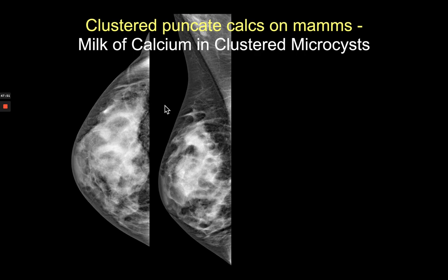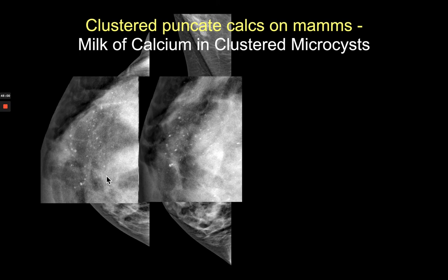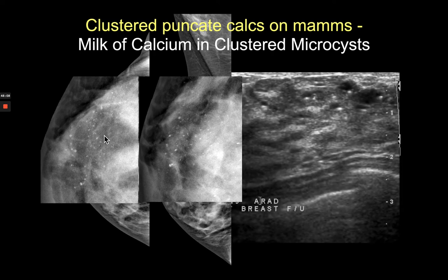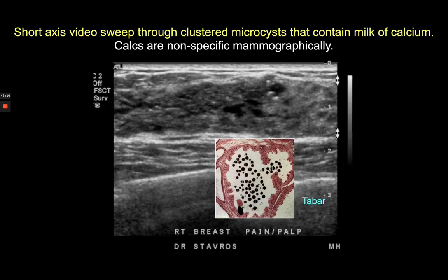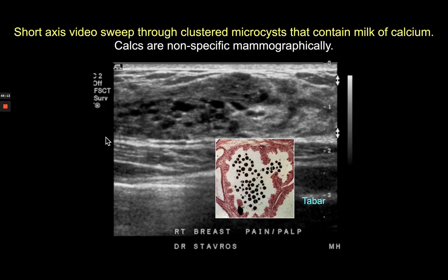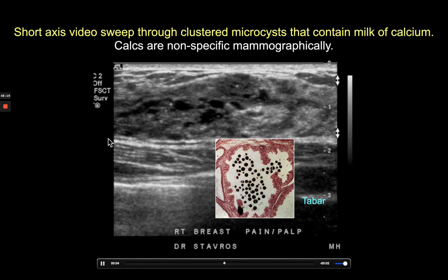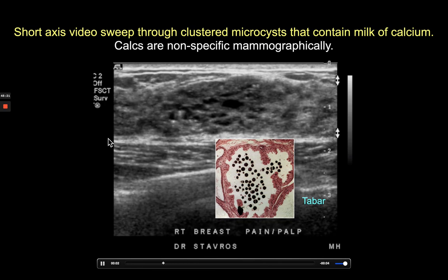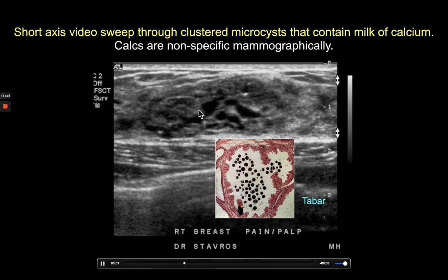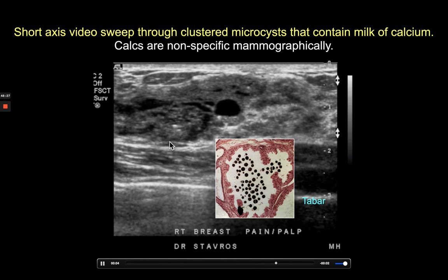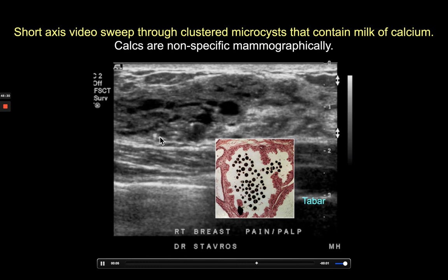Mammography can show smaller, more numerous calcifications and is generally better for characterizing them than ultrasound. Occasionally, calcifications that are mildly suspicious on mammography can be more definitively characterized as benign on ultrasound — specifically when we see combinations of calcium oxalate and milk of calcium in clustered microcysts, with dependent milk of calcium and/or calcium oxalate crystals visible at the bottom of many microcysts on a video sweep.